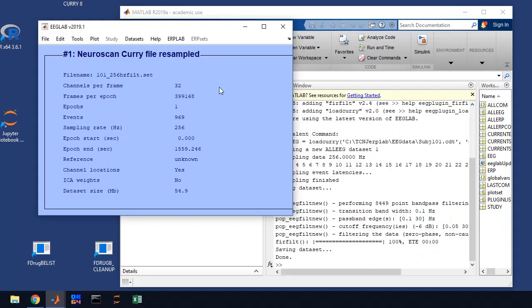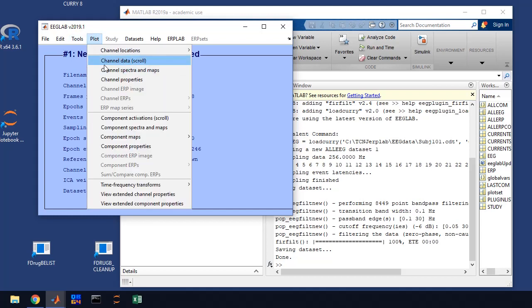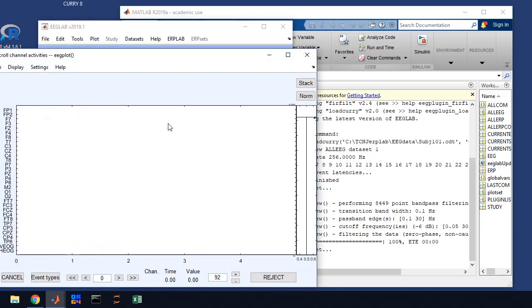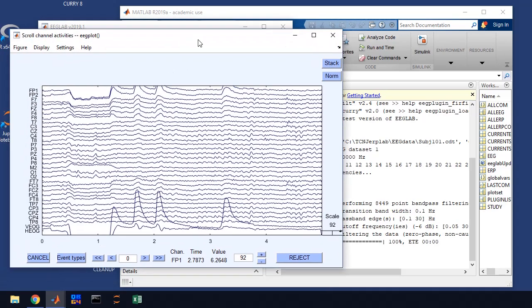Okay, in this video we're going to continue our processing. So what we've done is we've downsampled and we've filtered the data. Now we need to create events in our EEG file. Basically we're going to tag each trial. So let me show you. If you plot channel data scroll, you'll see the EEG data.